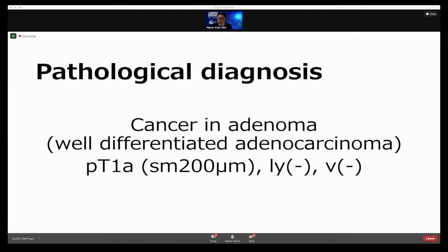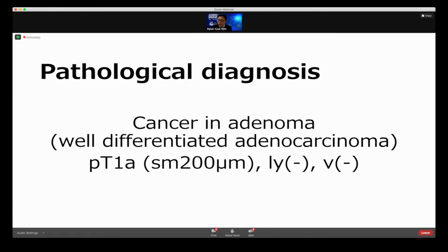Okay, so the question from the audience: what's the opinion on underwater EMR? Experts, underwater EMR is commonly used in Japan. Yeah, not so commonly used. However, in my area, underwater EMR is performed in many hospitals. But it's not so widely spread even in Japan. What was the setting of the electrosurgical unit for underwater resection? The setting is the same as conventional EMR. Okay.